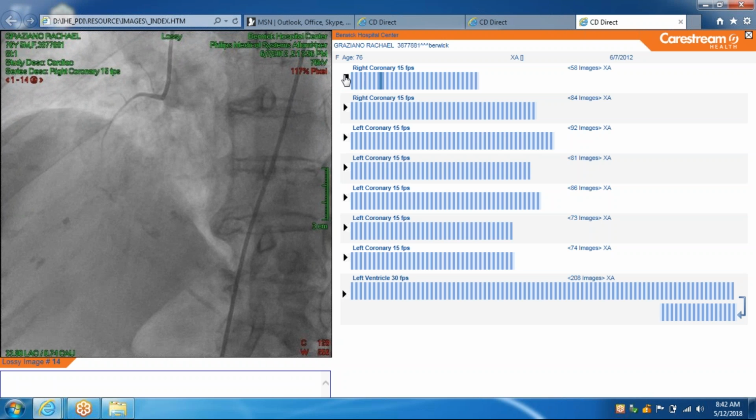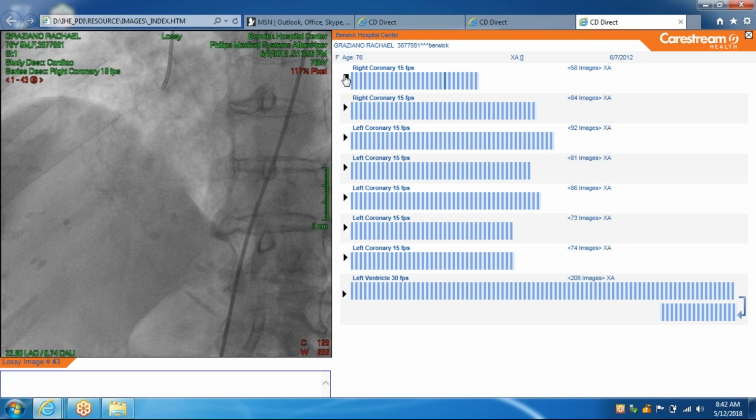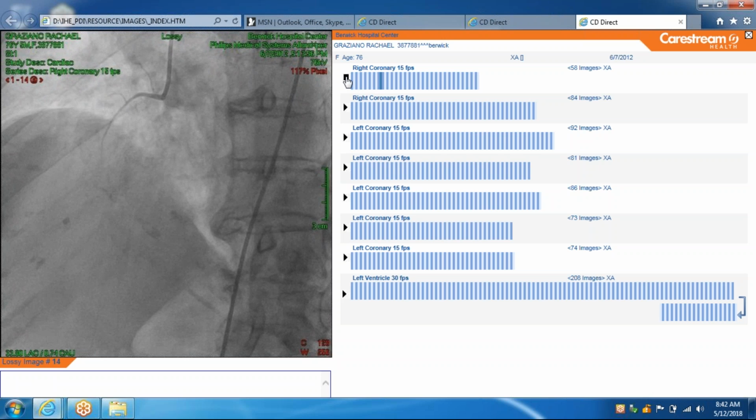So again, catheter in the right coronary artery, and you inject your dye, take pictures. So you need to observe closely what's happening here. You have to observe everything. If you look here, remember we said the size of this catheter is about 2 millimeters. This right coronary artery is small, it's tiny. The proximal portion is probably similar to the size of the catheter, but it tapers down. So this blood vessel is probably 1.5 millimeters. It's a very small blood vessel.